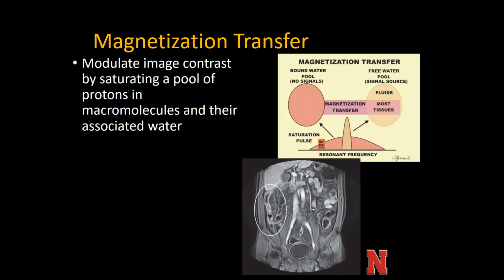Quite remarkable. Special pulse sequences are going to be covered later by one of the other radiologists, things like fancy BOLD imaging, stuff like that. I will talk a little bit about magnetization transfer imaging. This was really in vogue for a while as a research protocol. It hasn't really panned out.